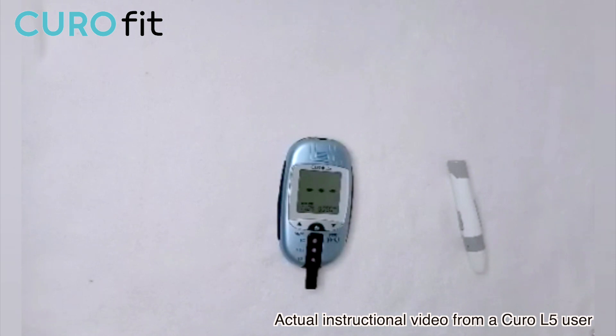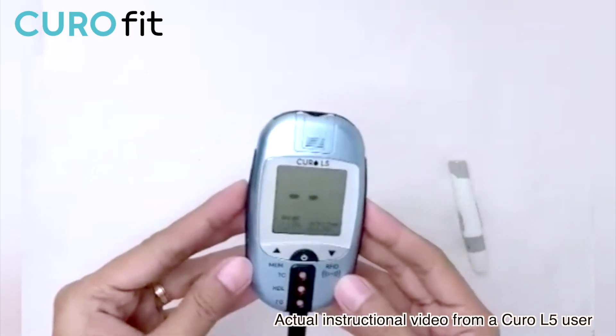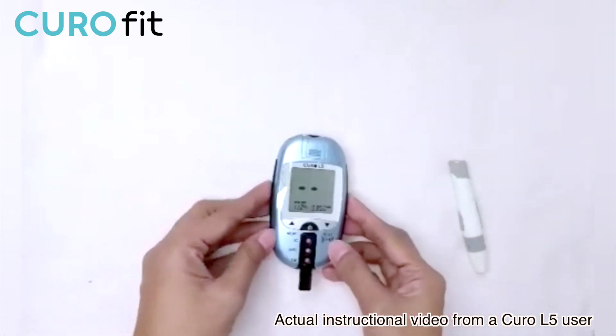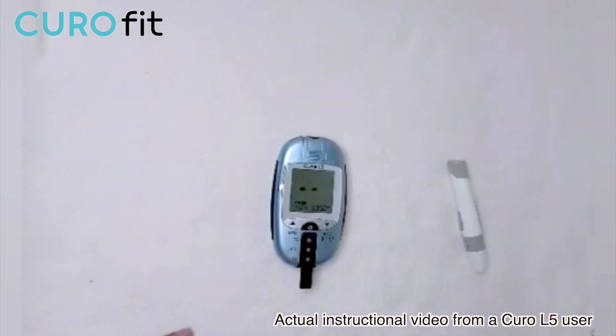As you can see, the device is now starting to read the result of the test. This may take one to two minutes to get the result. We're going to wait for the countdown, and once it's done with the calculation, it will display the result in real time. The meter will display the total cholesterol, triglyceride, HDL, and calculated LDL.